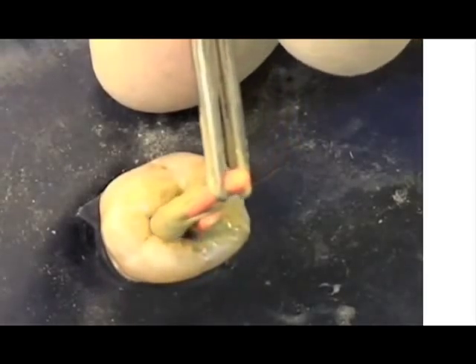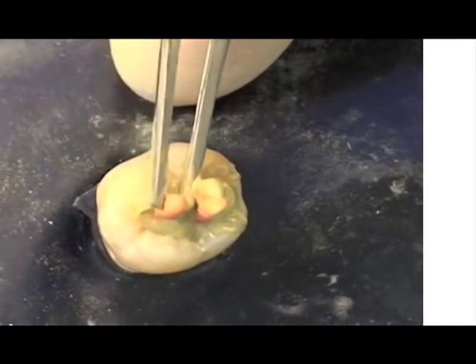In reality, after all the canals have been flooded with cement, I will place a point and burn the excess off at the level of the orifice before proceeding to cement the next point. As you can see, the canals appear to be well filled with no voids using three single gutta-percha points.